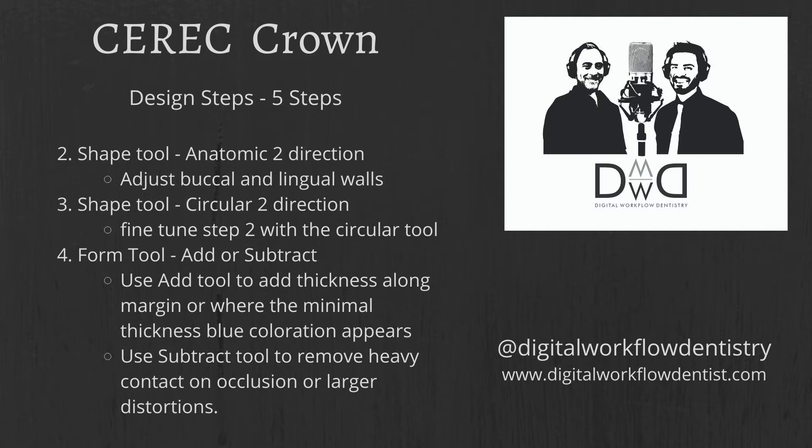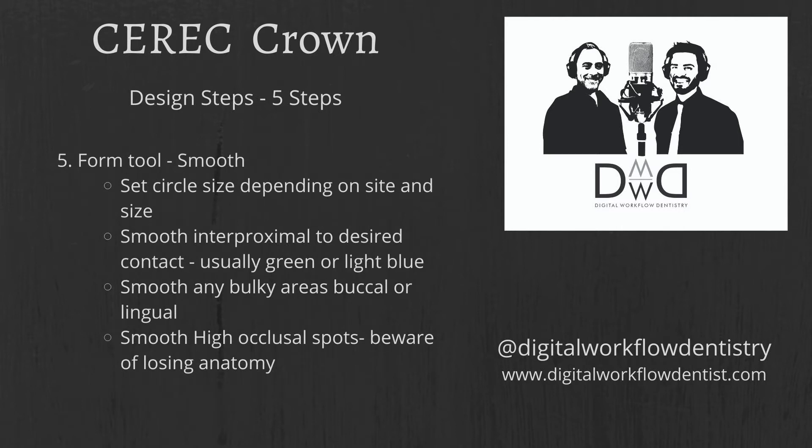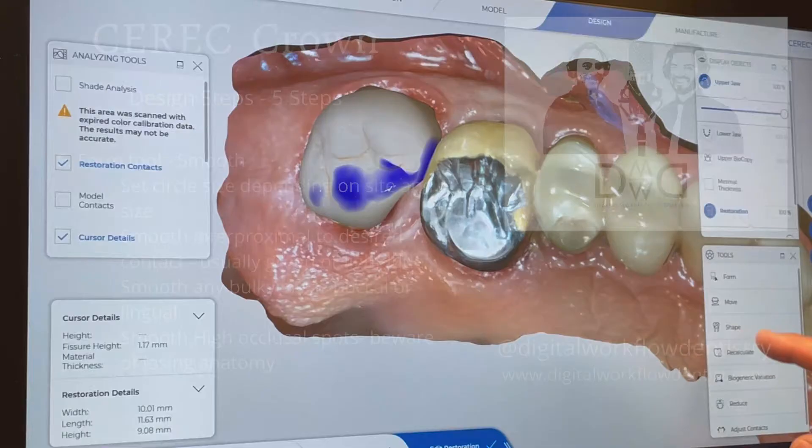Next, move into shape tool circular two-direction — set the circle size and fine-tune. Step four is the form tool — add in areas along the margins or anywhere with minimal thickness to eliminate blue coloration. Use the subtract tool to remove anything overly bulky or for heavy contacts. Step five is the smooth tool under the form tool. Set your circle size and smooth the interproximal to reach a green or light blue contact. If it's a last molar you can leave a little yellow since there's no tooth distal to it. Beware that overusing the smooth tool will cause you to lose anatomy.